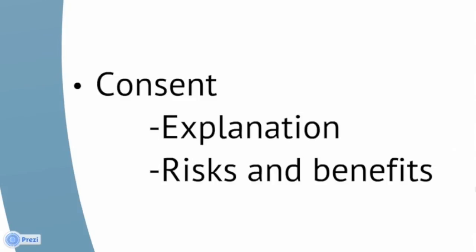In order to do this, you should provide the patient with a simple explanation of what you are going to do and why. You should also describe the potential risks, for example, infection and expulsion, along with the benefits such as emptying the bladder or measuring urine output. After this, check the patient's understanding and ask if they are happy for you to continue.